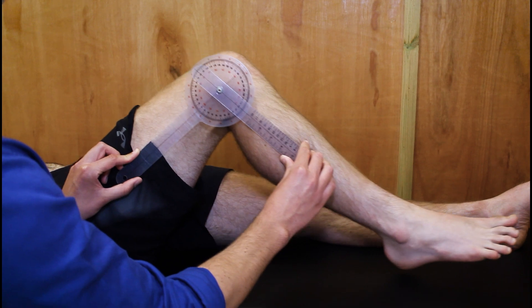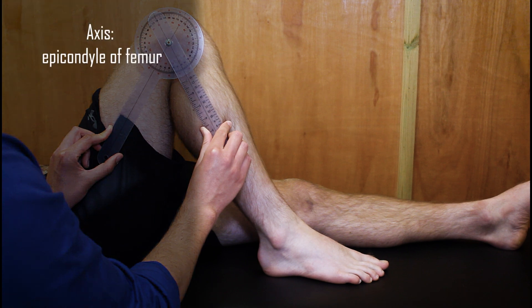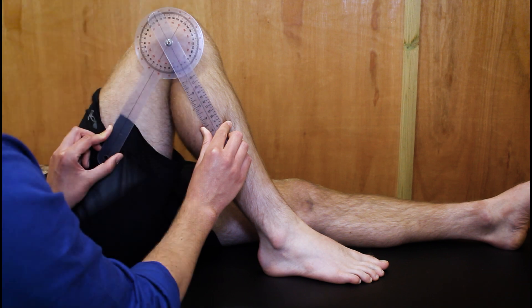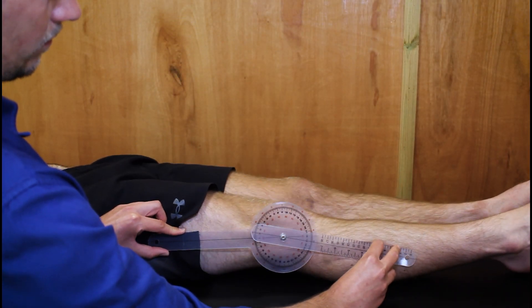To measure knee extension, the patient is positioned in supine. The axis of the goniometer is placed over the lateral epicondyle of the femur, with the stationary arm parallel to the femur pointing to the greater trochanter and the movable arm parallel to the fibula pointing to the lateral malleolus. Ask the patient to straighten their knee as much as possible.